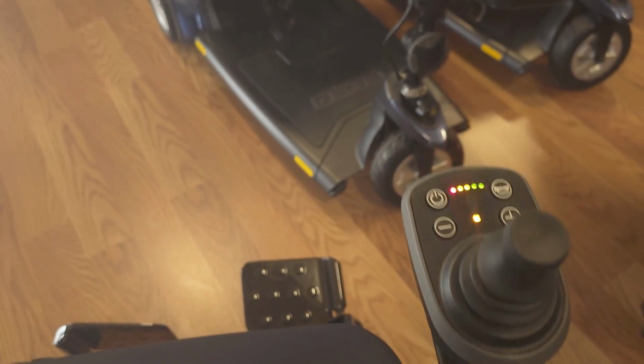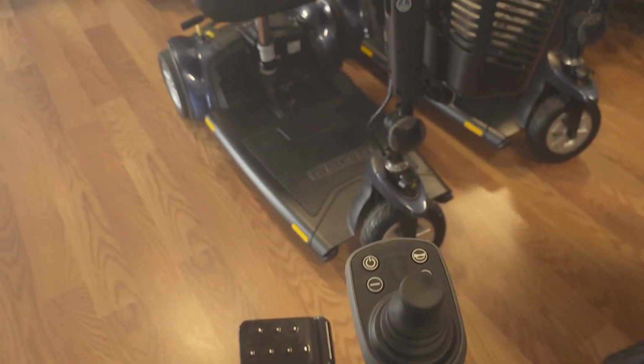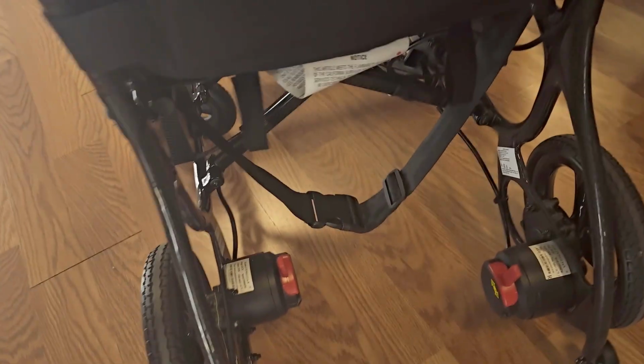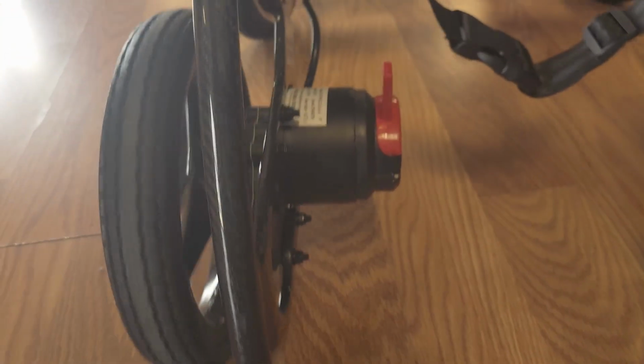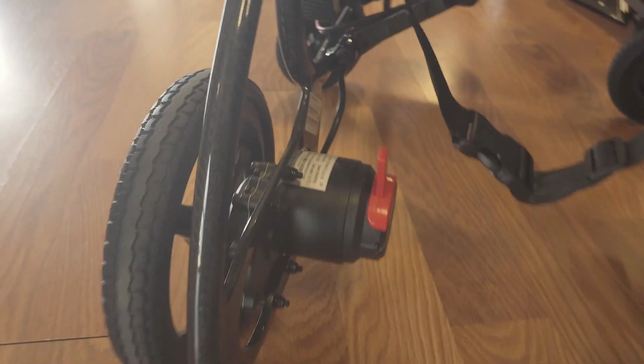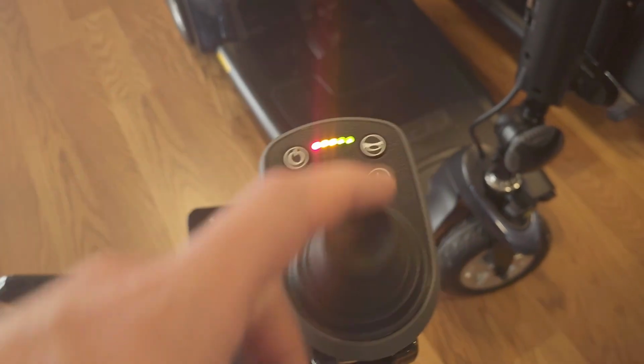If you turn on your unit and you just start getting a beeping, flashing lights, a lot of the times your unit is in neutral, meaning these motors have been switched from the drive mode into neutral. So if you can push your unit, and this goes for scooters too, and the wheels move, typically it is in neutral. So you'll just want to pop it back in drive, power it back on, you're good to go.